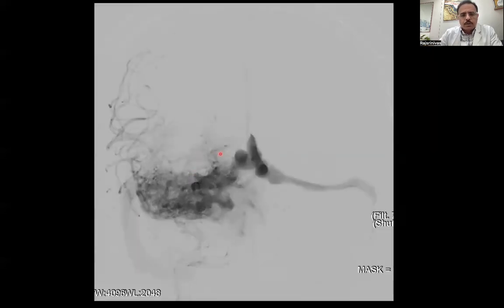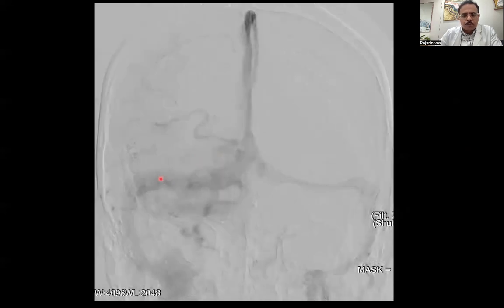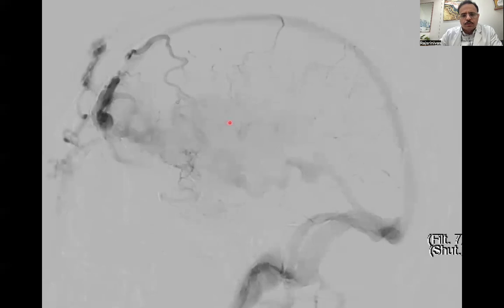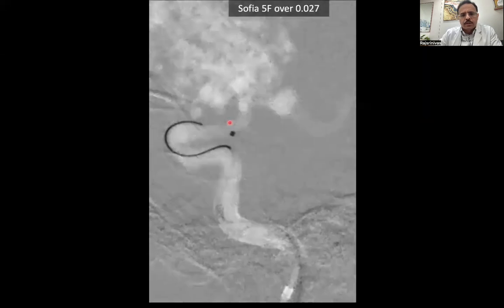The angiogram again shows those two nidal aneurysms which are on a perforator. We can see them on the lateral angiogram, large diffuse AVM. So the plan is targeted embolization of the AVM. Distal access is very useful.